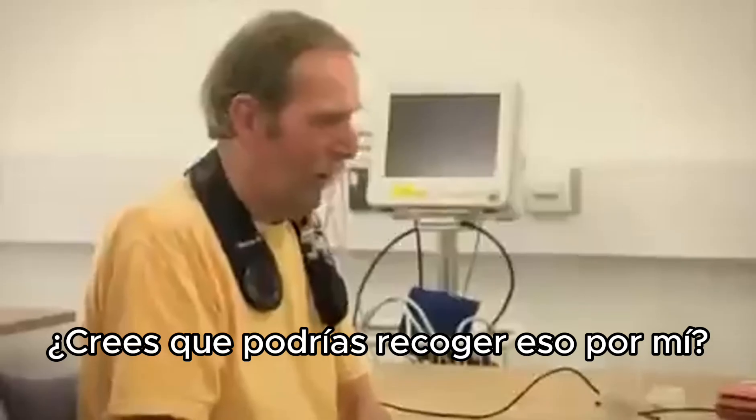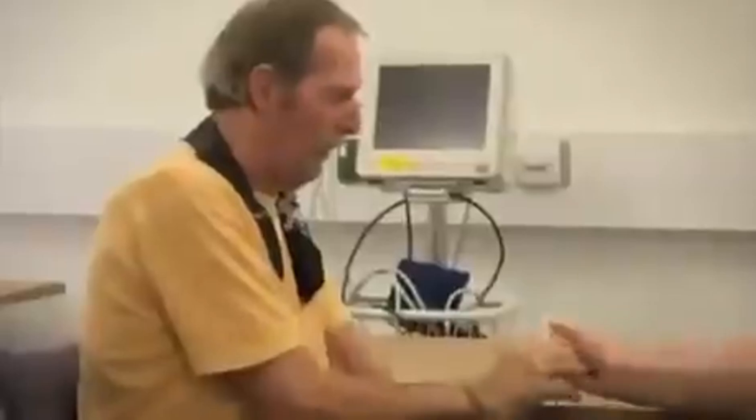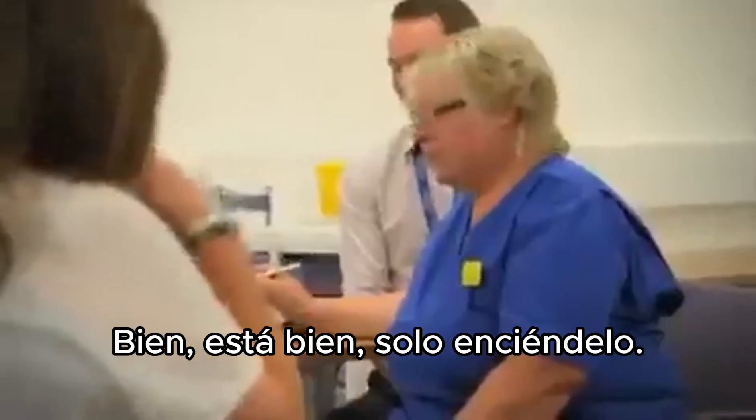And the real test. Do you think you could pick that up for me? All right, OK. Shall we switch on?